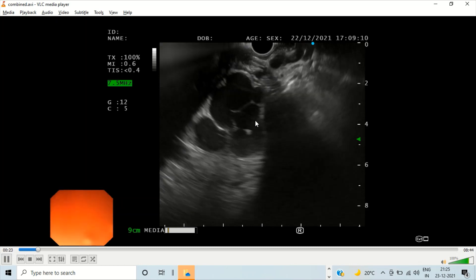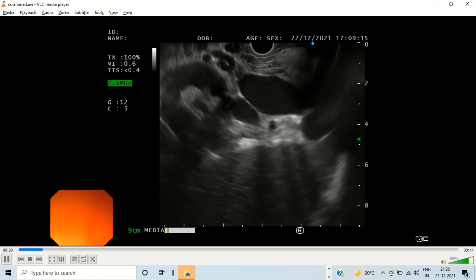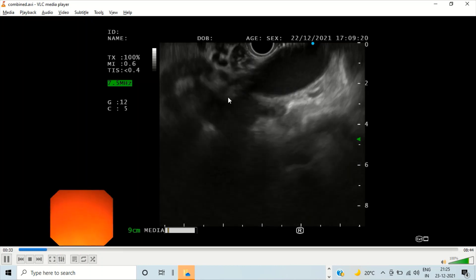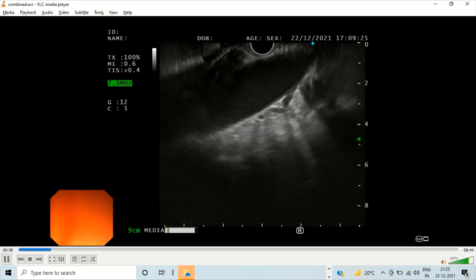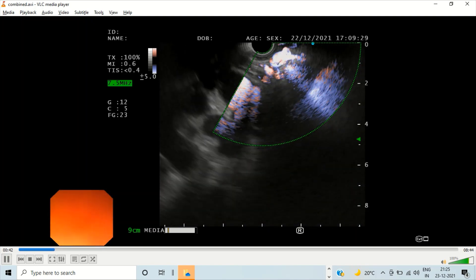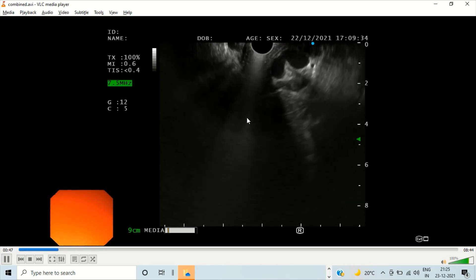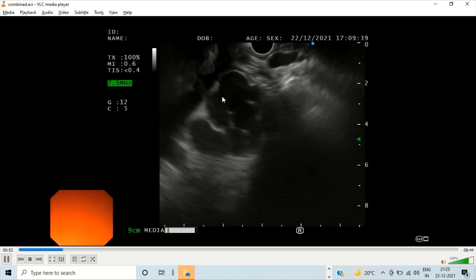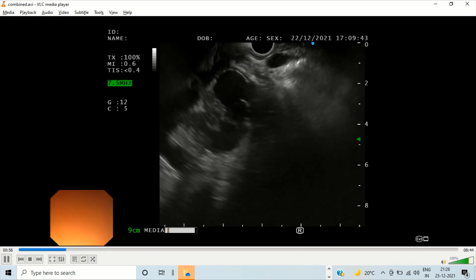What we are doing here is actually torquing and completely rotating the scope towards the right. We can see the gastrorenal shunt — we will talk about that later. We are completely rotating towards the right such that it rotates even further and begins to face towards the fundus. Now we are actually facing forward and we still have the gastric varices in position. This will make therapeutic maneuvers easier.